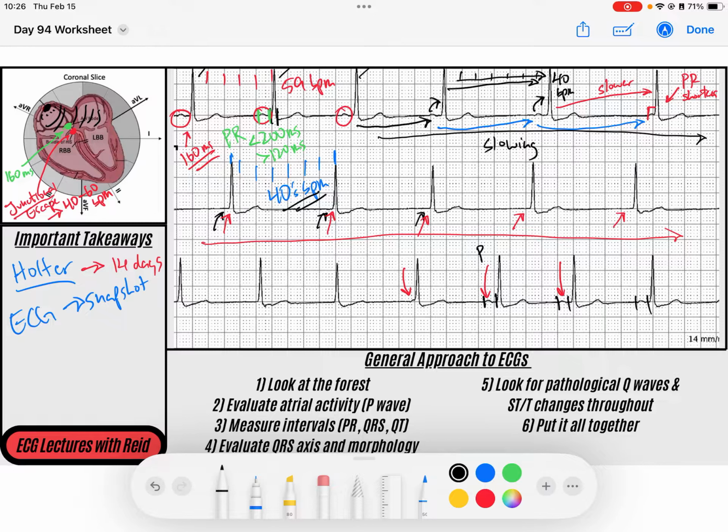And so, yeah, that's what we see here. So I hope this helps you understand just good physiology. And if you have any questions about this rhythm, feel free to throw them down into the comments. I think that it's just good to understand what is happening, and so you correlate that to that anatomy and electrophysiology to potential symptomatology, and then you can make great decisions.